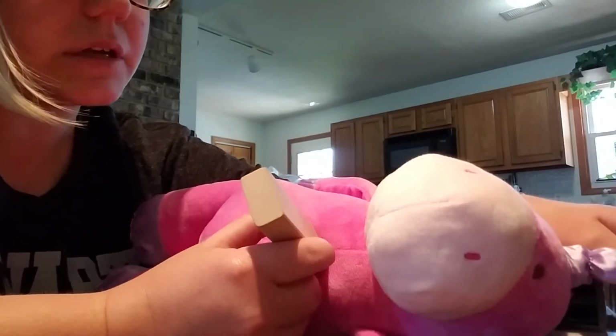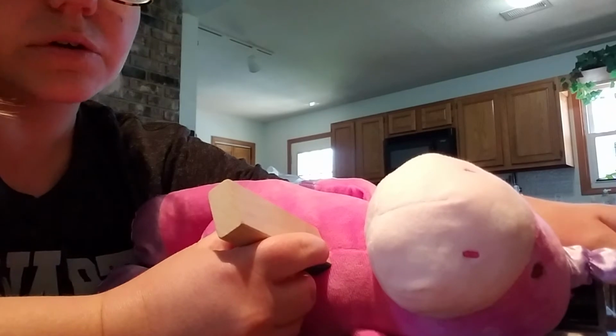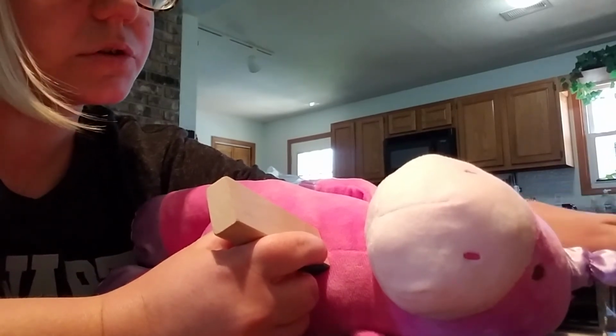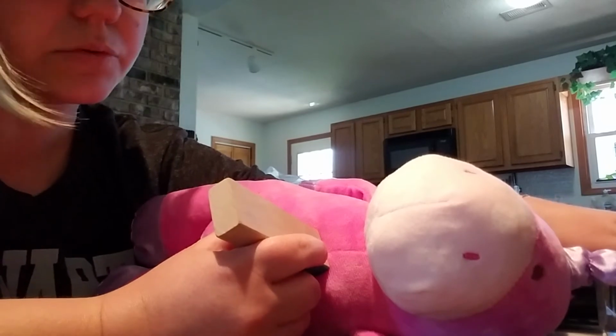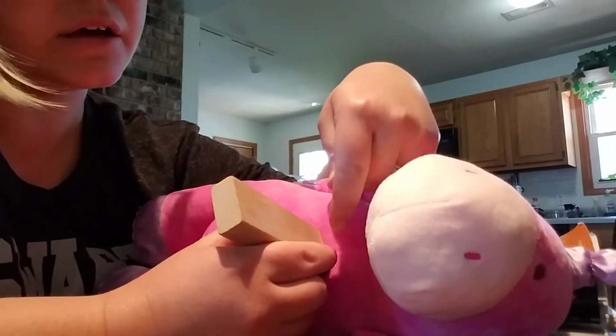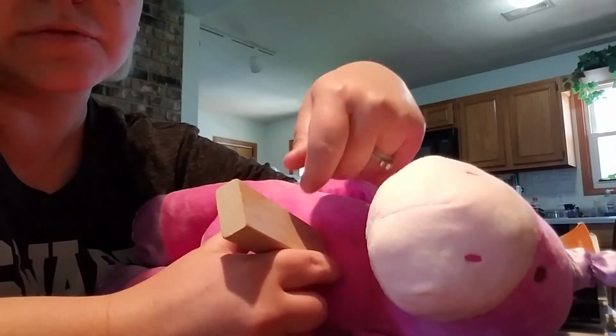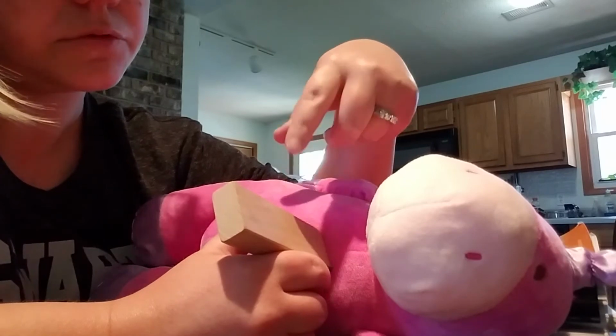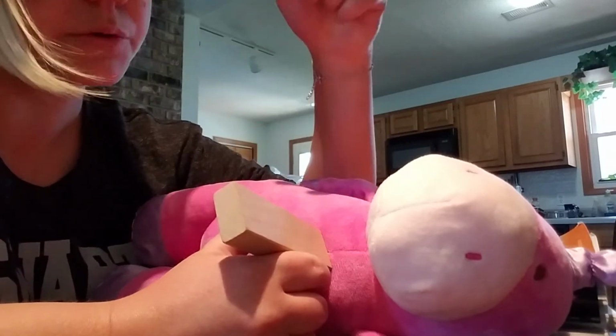You have to pan a little superiorly to start with your aortic valve. So you're going to have your aortic valve, you do your cine loop, you do your color compare, and you'd run your M-mode through there. And then you would do a color compare of your pulmonic valve, which is in your window with your Doppler, and then your tricuspid valve, which is in this window as well for your Doppler.